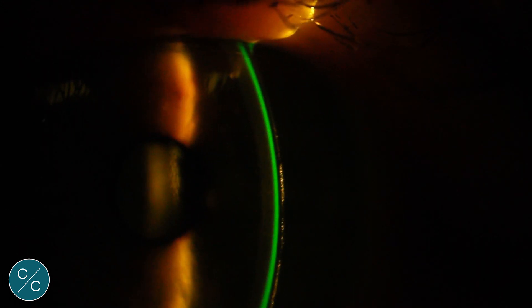We're starting off with a tear film of 300–350 microns, which will decrease as the patient wears the lenses by approximately 100 microns. So at this point we can see we've got adequate height and it's quite okay for the patient to commence wearing the lens.